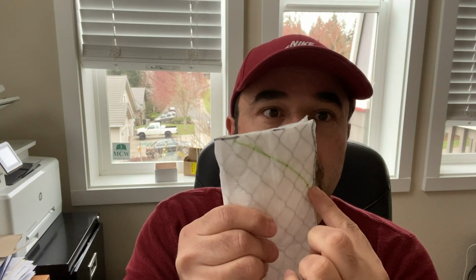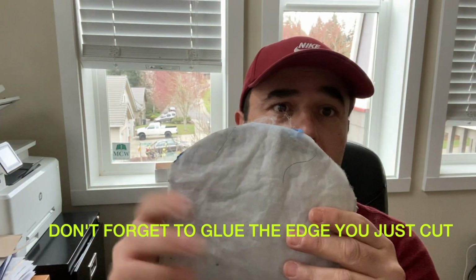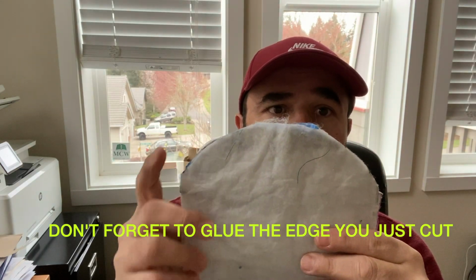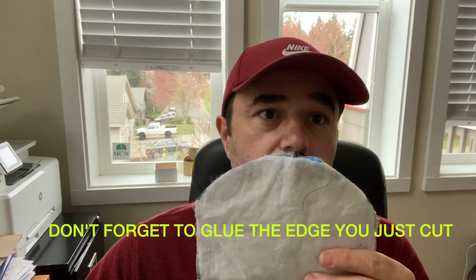Once you have that, then you'll fold it in half, and all you have to do is cut along the line on one side. You'll definitely need these heavy-duty shears to do that, because you're cutting through some wire. All right. So the next thing you do, you'll have something that looks like this. You can see that this has been cut, and we'll start again molding it to your face.